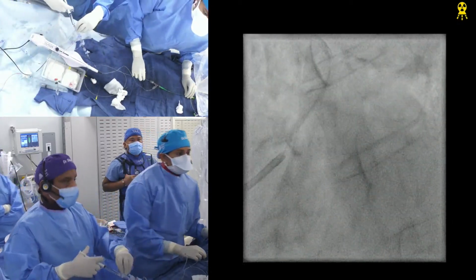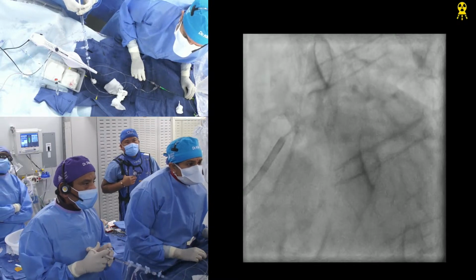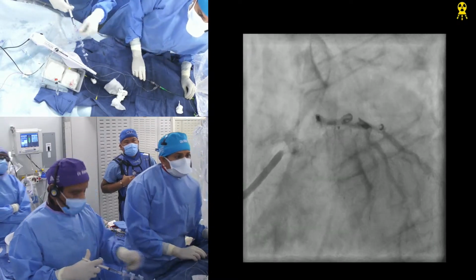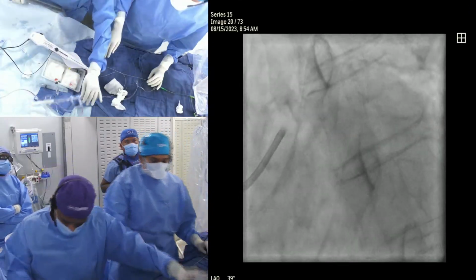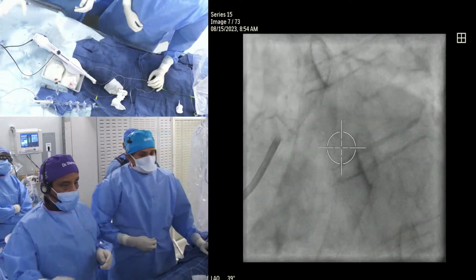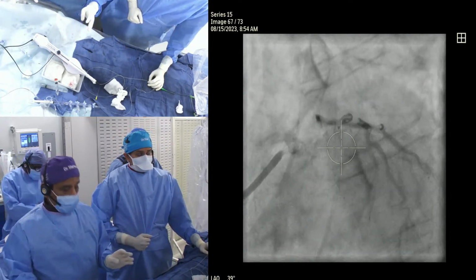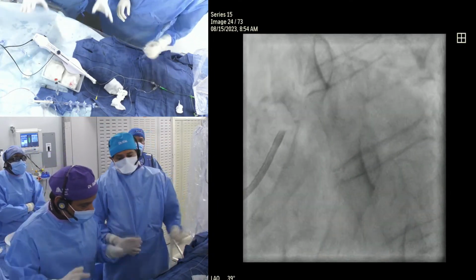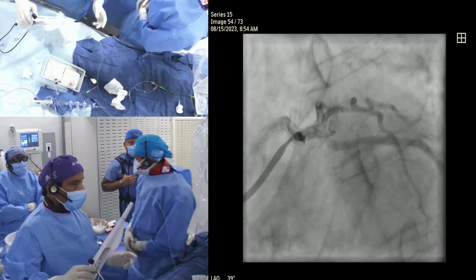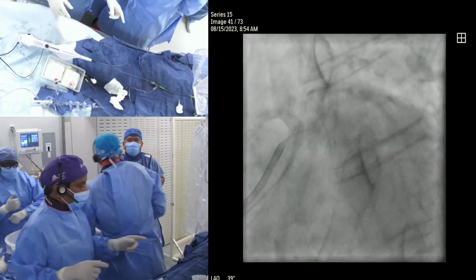Go. Guide a little more in. Yeah. You can see it. There. Yeah, it is on the superior surface. But just to say, what will happen is it's going to create a gutter. Don't be alarmed that you'll see the artery look messed up, a little tornado in there. But that's expected. Let's go. Have a balloon ready. Yep, balloon is ready. Always balloon should be ready on the table. Your wire should be ready on the table. Let's go.